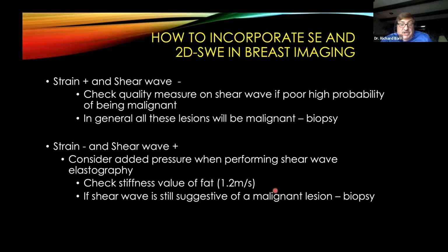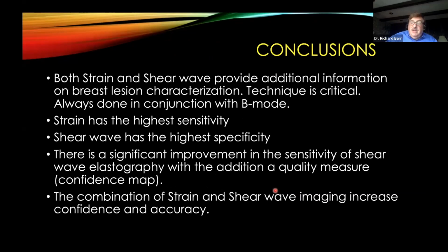Now, I will tell you that it's really easy to do both on the EPIC because the technique is identical. There is no learning curve for strain imaging. It's the same as shear wave imaging. You just hold the probe still. You want to try to be perpendicular to the lesion. You let the patient's breathing do the motion, and you just can flip from shear wave to elastography strain by just pushing the buttons. You don't have to move the transducer, and you can get excellent images by doing that. So with under a minute, you can do both of these very easily, see the results, and be able to tell the patient a conclusion of what you think.